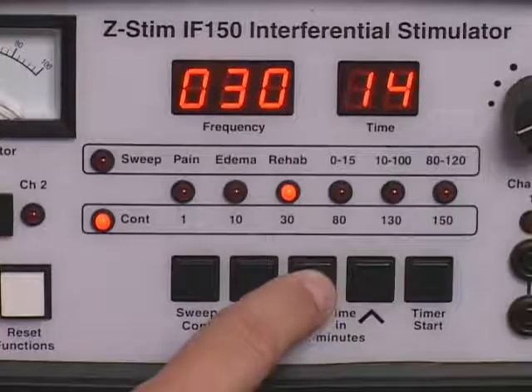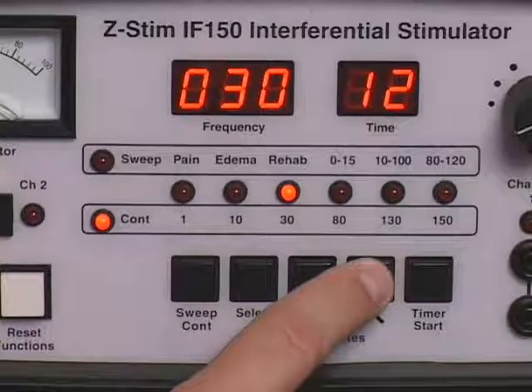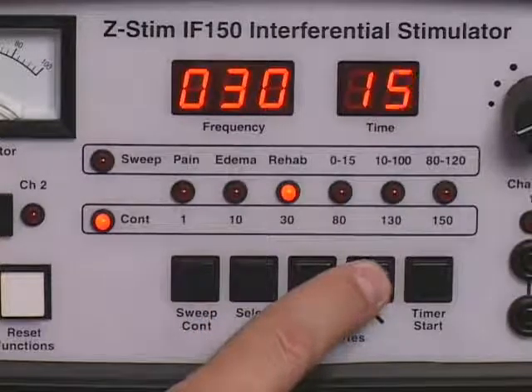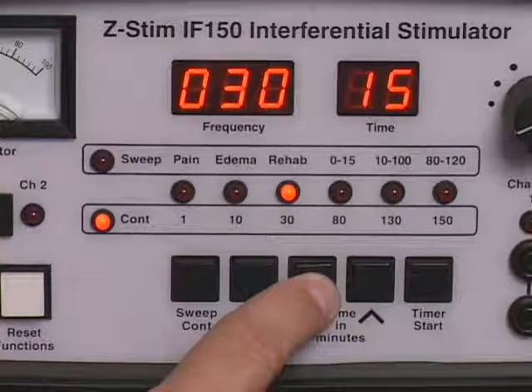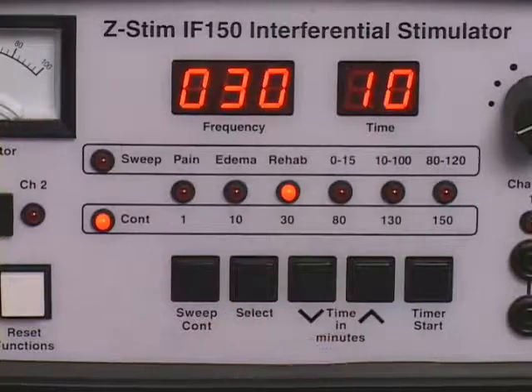Set the treatment duration using the time controls. To adjust in one minute increments, press and release the time control. For rapid adjustment, press and hold the time control until the desired treatment duration setting is reached. The treatment duration will be indicated on the power timer display. Treatment duration may be reduced or increased during the treatment period.